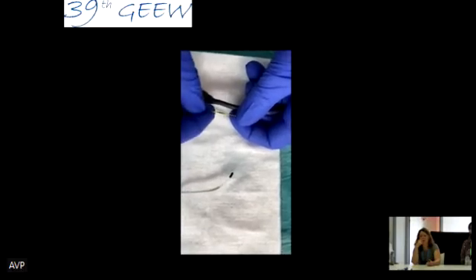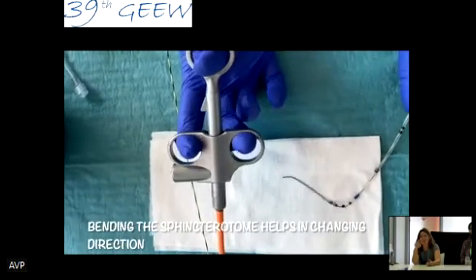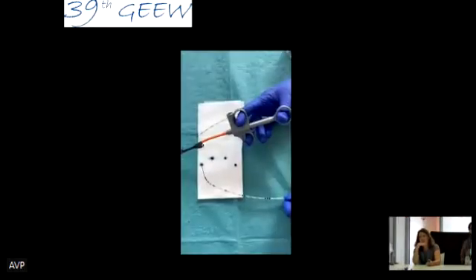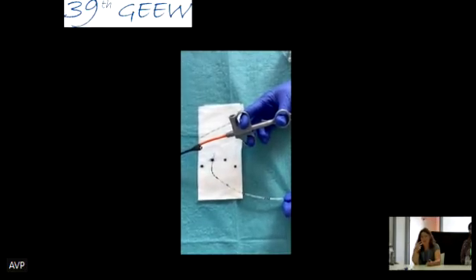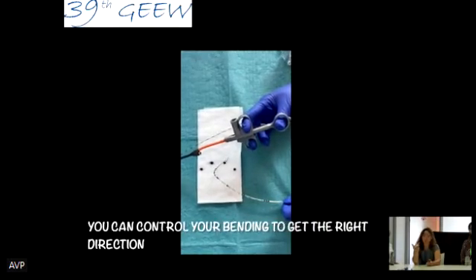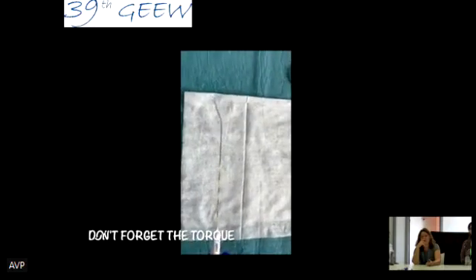So this is, you see that the guide wire is inside the sphincterotome, and when you change it, you see the different degrees of orientation that we can do. It's not on off, as Sonia is saying, it's not boom boom. So you really have to control your movement. I want it to be a lot bended. I want it to be a little bit bended. So you really can do that with the sphincterotome and progressively find your best direction.